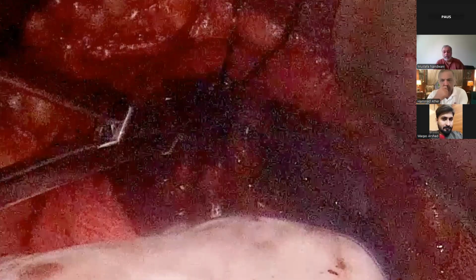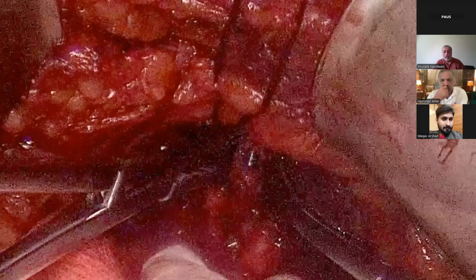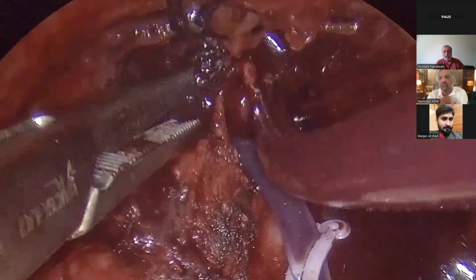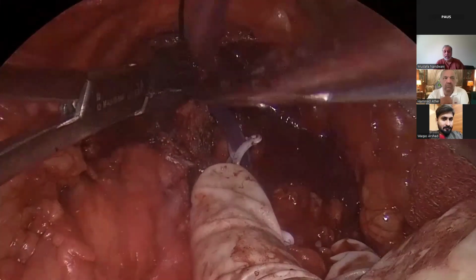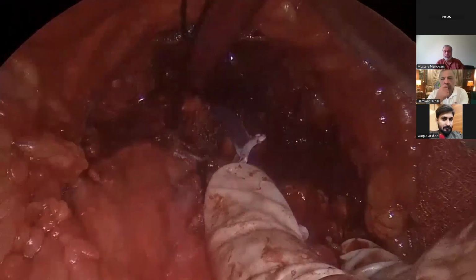So you'll put a long clip and then pull this. Okay, you can see this now. You pull the clip, and at this point, what I usually do is put two Lapra-Ty clips on this so that the balloon remains intact. And then I pull as much as possible, and under vision, I cut the posterior wall.